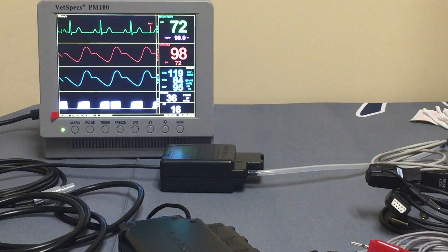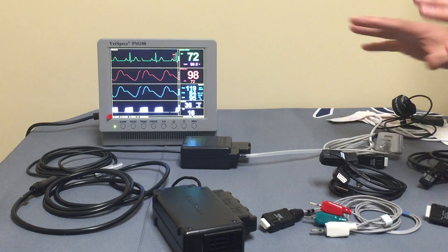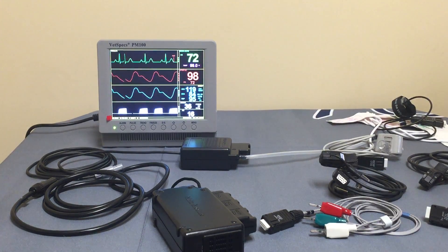I'm going to set this over to the side. What I'd like to do now is dive in a little bit more into the blood pressure monitoring.